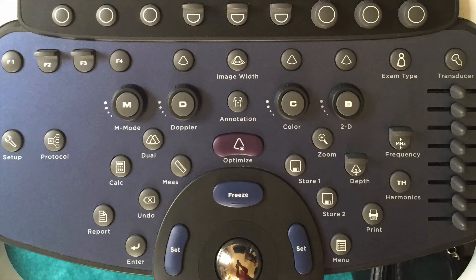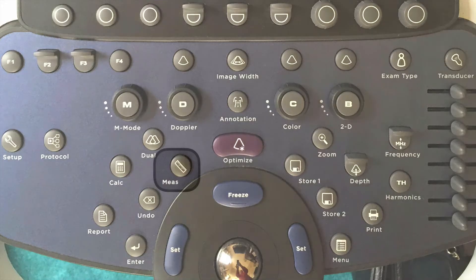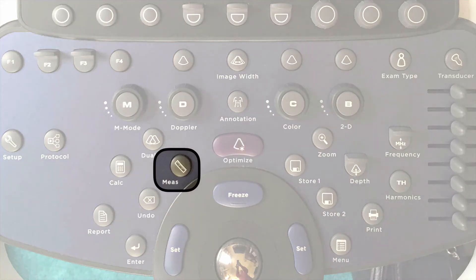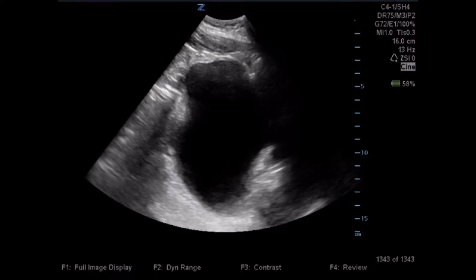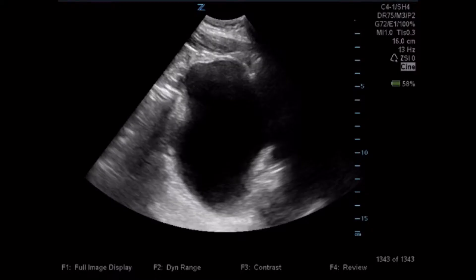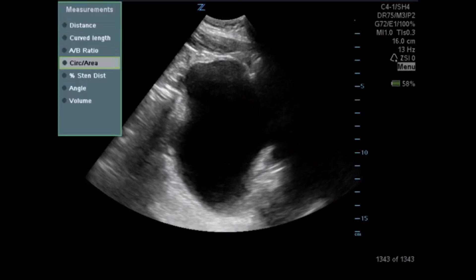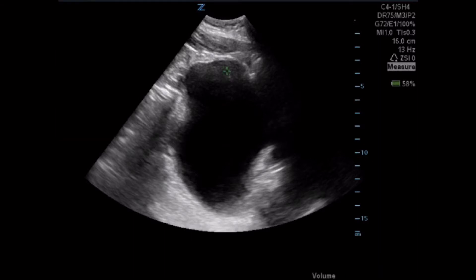This involves the measurement tool. You will hit the measurement tool, but instead of hitting it once, you're going to hit it twice. When you press it a second time, the submenu pops up. You're then going to select volume.